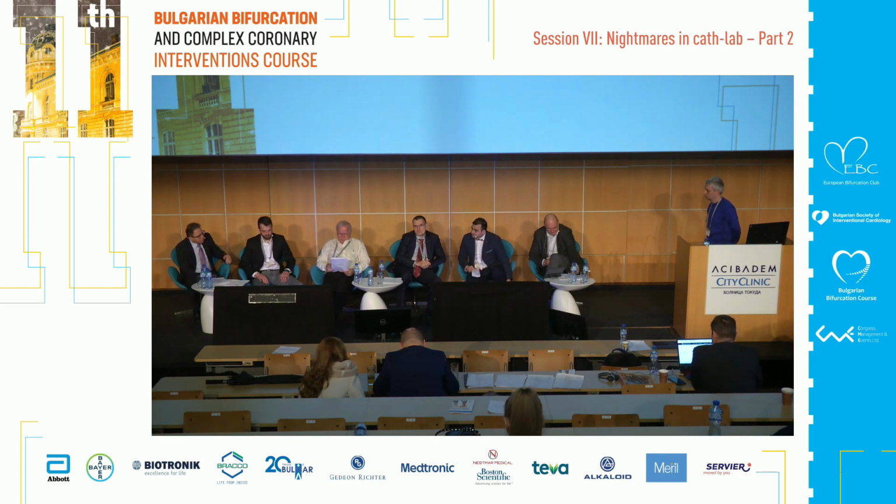I congratulate you because in the majority of cases this retraction doesn't give you stability of the valve, and in many cases there is a pop out, or again, let's say, distal propagation of the valve, and it is very important to check with ultrasonography whether it's still good or not.